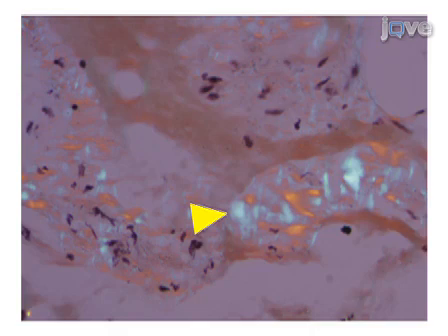Blue birefringence of collagen fibers, indicated by the yellow arrowhead, is usually present in almost all specimens. In our experience, this collagen-related blue birefringence may be difficult to differentiate from the apple green birefringence of amyloid. This is a significant pitfall during the interpretation of Congo red stained specimens under polarizing microscope. This electron micrograph shows straight, non-branching, randomly scattered 8 to 10 nanometer diameter fibrils consistent with amyloid in a blood vessel wall.